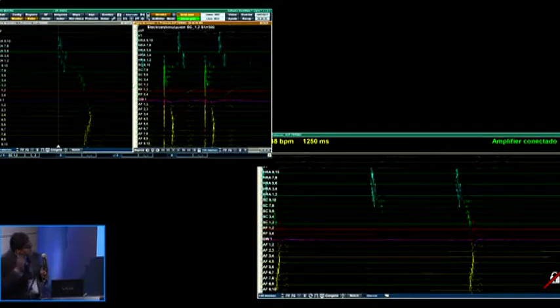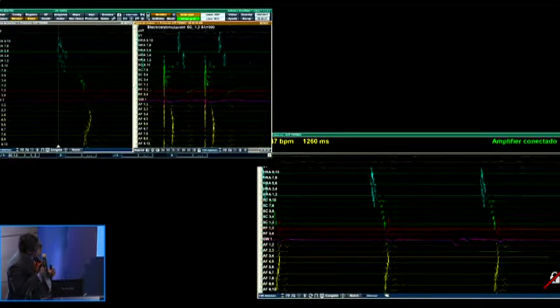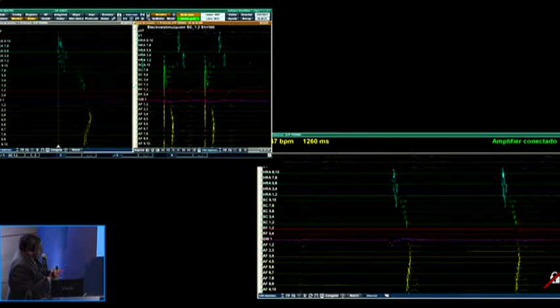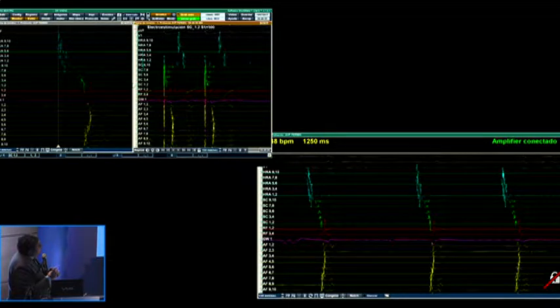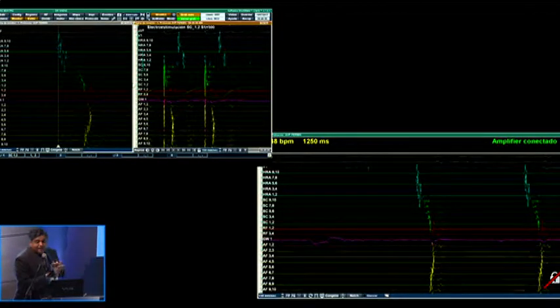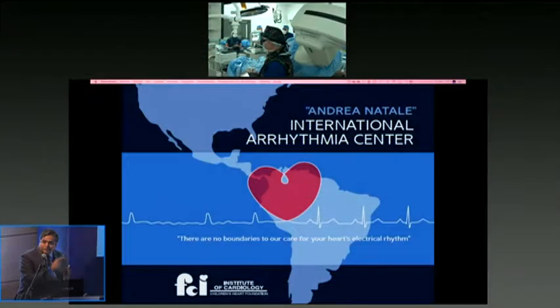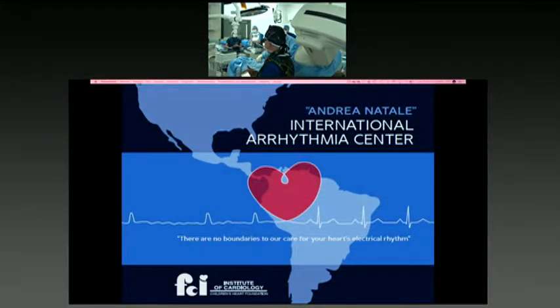No, they are going to switch rooms now. Por favor. The room and we'll come back to you. Si quieres tratamos de inducir. It's actually very nice. Sometimes they actually get block across the mitral isthmus post alcohol injection. So can we go to the cryo lab?